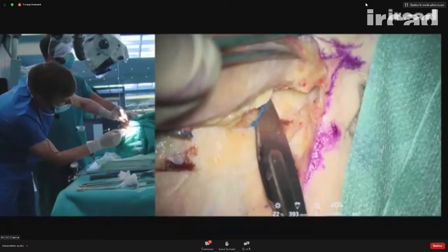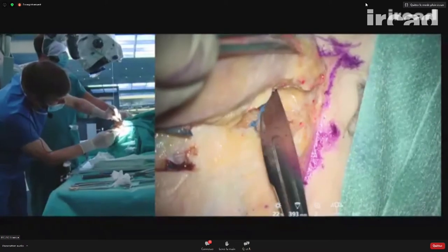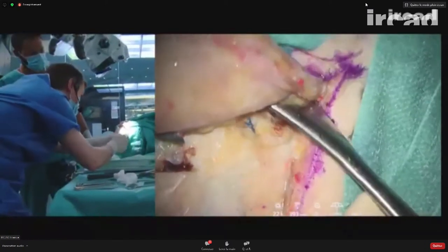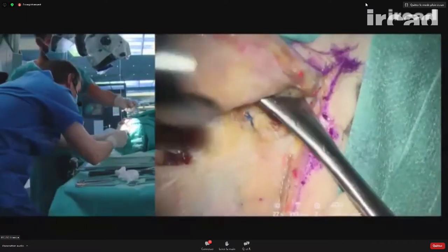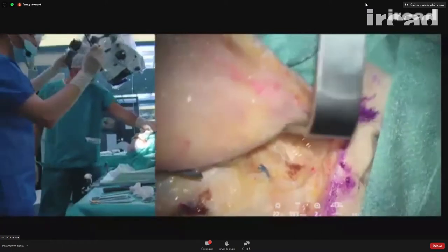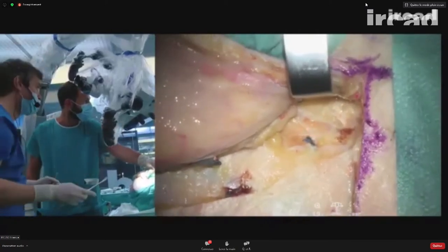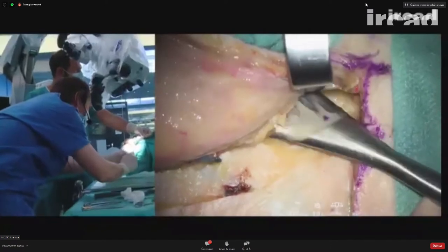If I am far posterior, I can cut a little bit more down and protect. Most important is to be as posterior as possible.